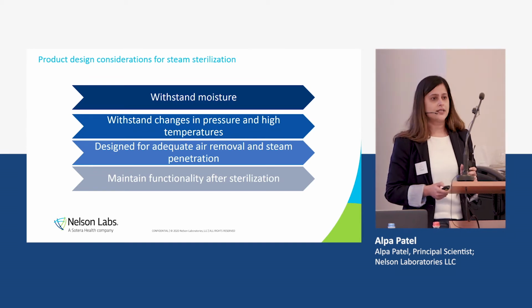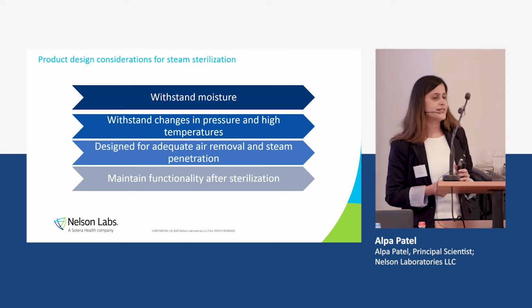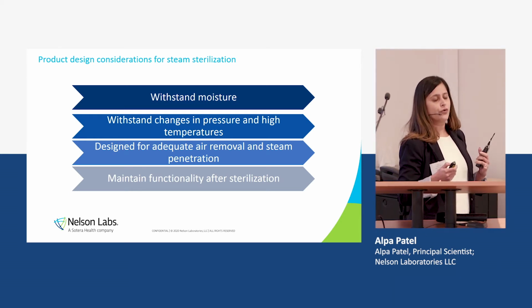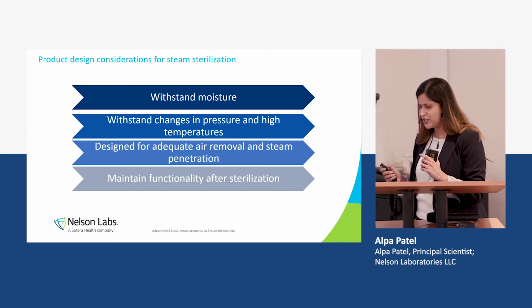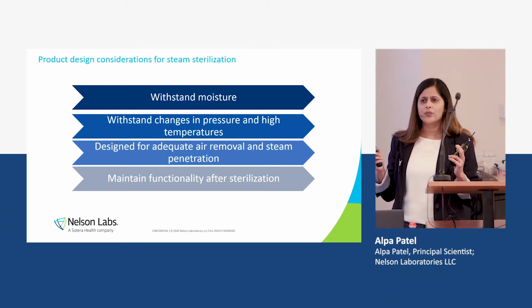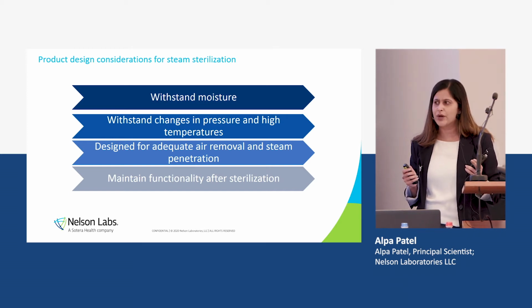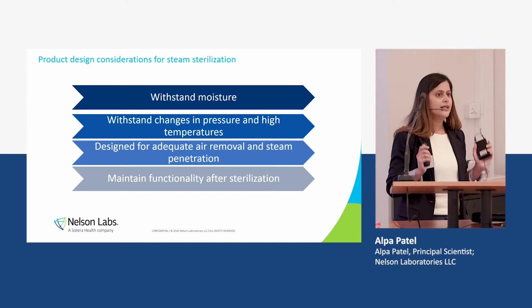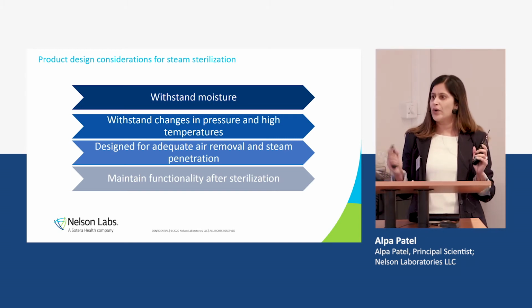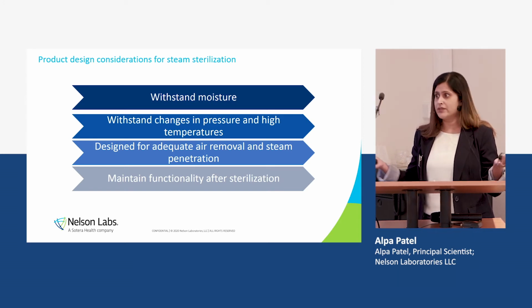Now, believe it or not, I've got all this stuff mentioned here, and I'm sure when you guys are doing your risk assessments, you know what to look for. But every year we get one person that sends us a device, we look at it and we advise and say, I don't think this is going to go through the sterilizer, it's probably going to melt. They're like, no, we've done our risk assessment, I think it will work, let's just put it through one cycle and see. And so we trust, we're like, okay, they've done their risk assessment.